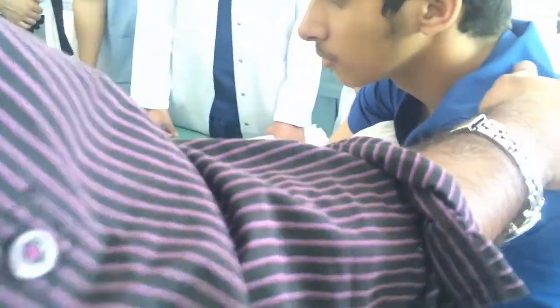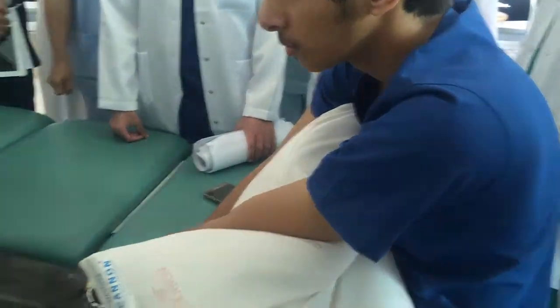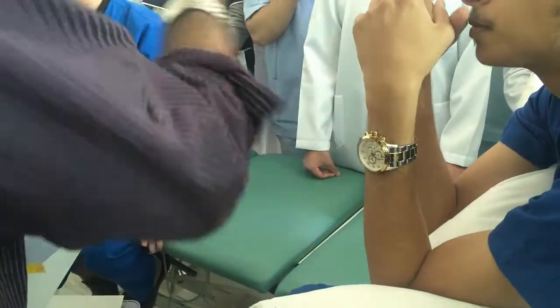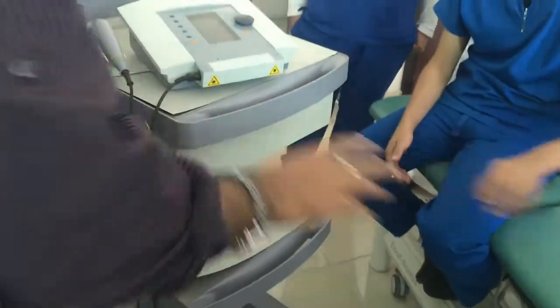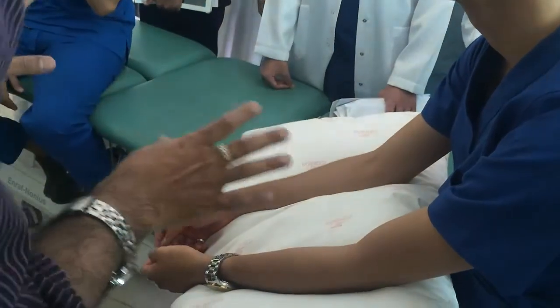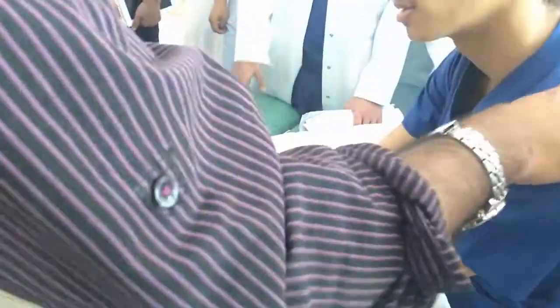So you have to position the patient properly, comfortably. All those things, whatever I have mentioned in the practical, we should explain. Then you should give the treatment. After the treatment, you should switch off and remove the laser, put it to one side. I have to remove the pillows and we have to inspect the treated area. You should ask him whether he has any problem or not. Explain to him, please come tomorrow or day after tomorrow. If you have any problem, please let me know.